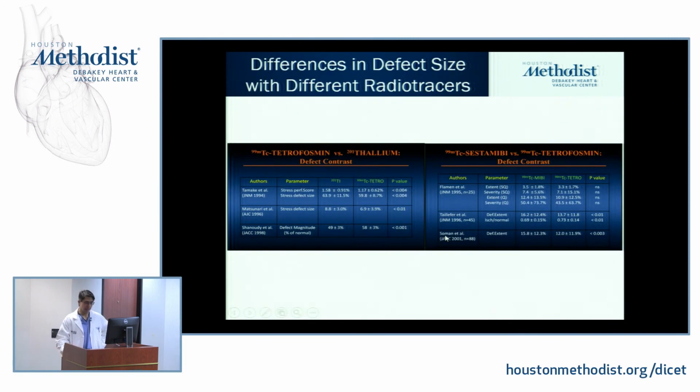Okay, and this is just a slide showing you that if you were to look at defect sizes using the technetium agents versus thallium, you get higher diagnostic accuracy, again, with the technetium agents.